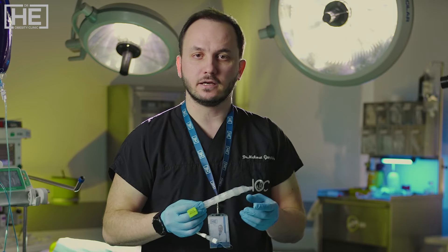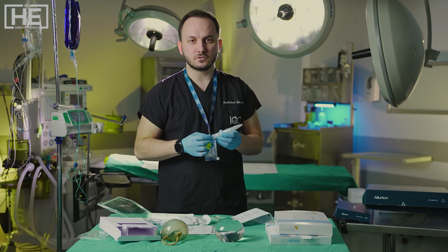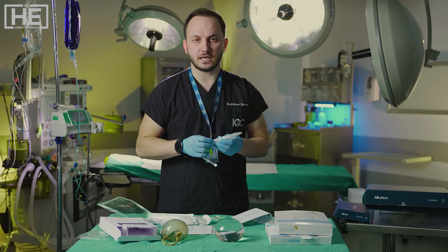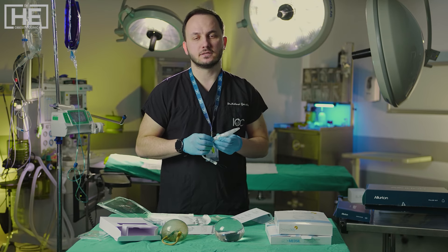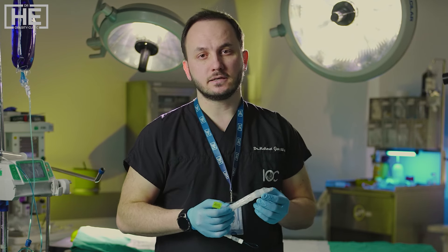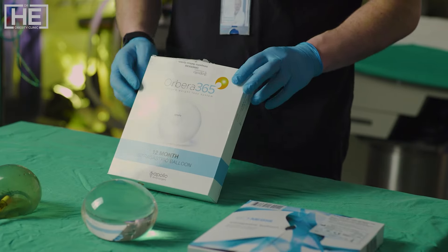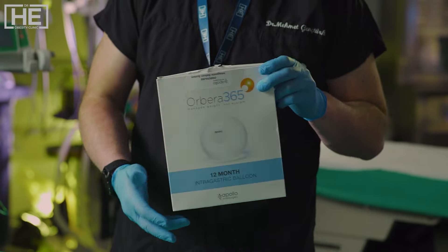Of course, if you reach your goal earlier than one year, we can remove it sooner. The maximum time limit is one year. The Spatz-3 adjustable balloon received FDA approval in 2021, making it an FDA-approved, one-year, fully adjustable intragastric balloon.